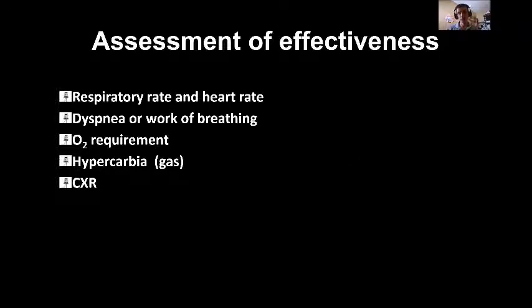We rarely use 4. Sometimes when we step down we go to 4, but we rarely use it. Usually we start with 5 if you have obstructive apneas, but if you have a respiratory problem, the standard is 6 and then you go up. I do not advise above 8 in the first few days, like the first 3 days of life, but after 1 month you can go up to 15. And our mean in 1-month-old babies who need CPAP is 11.